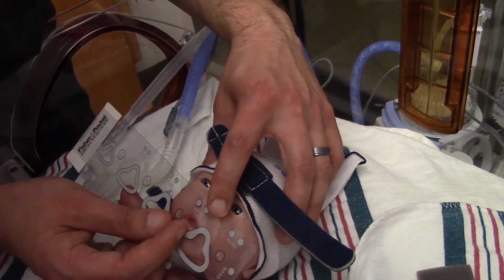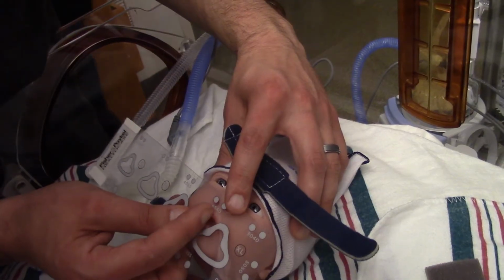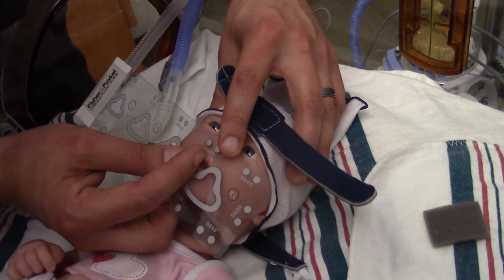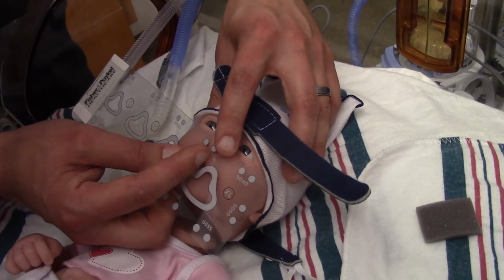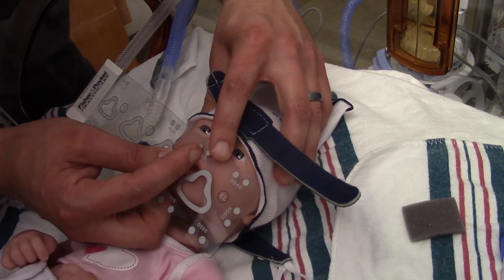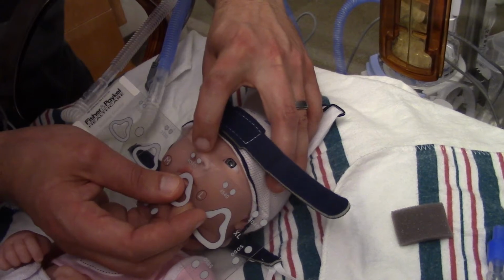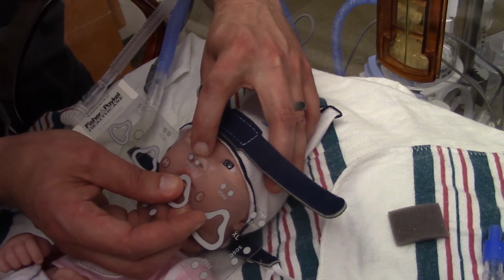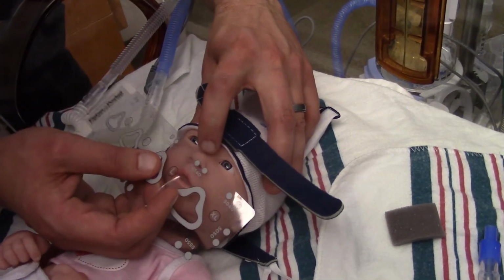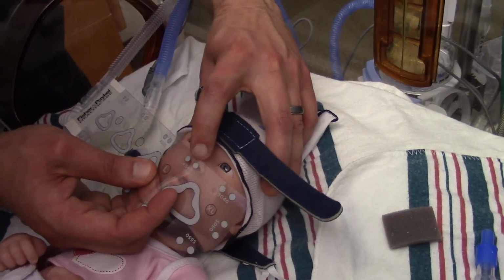we can line up and we can see that 45, 40, we have sufficient coverage of the nares. We want to shoot for about 80 to 85%. We have sufficient coverage of the nares, and also it's wide enough that it will fit over the septum. If we go down even, we can see that the prongs are going to start rubbing against the septum and start creating breakdown. And it does not take long. So 45-40 would be the prongs that I would choose for this child.